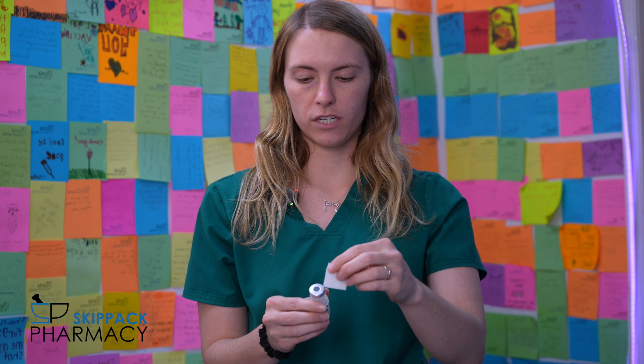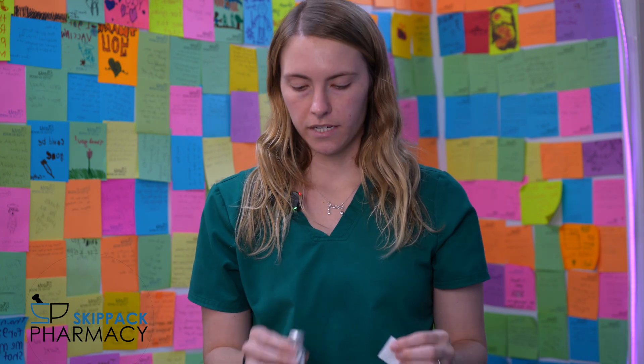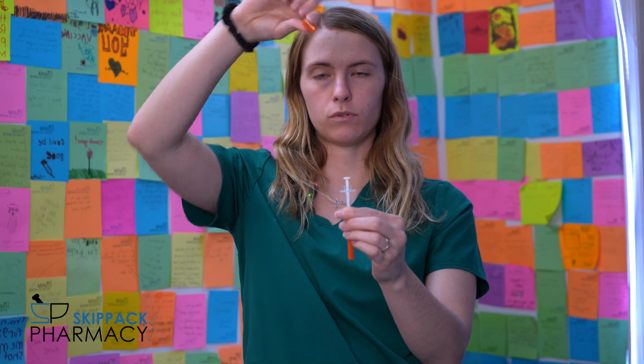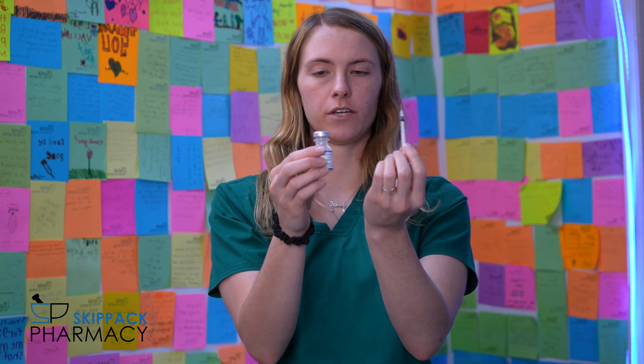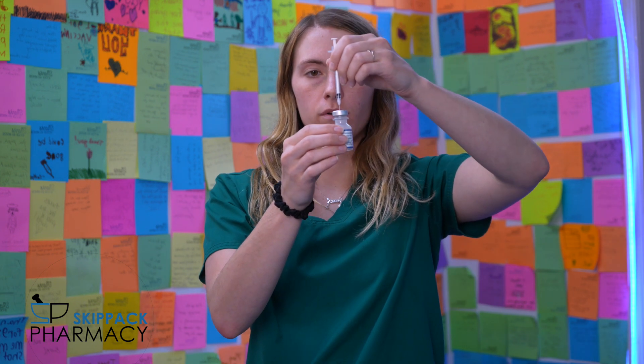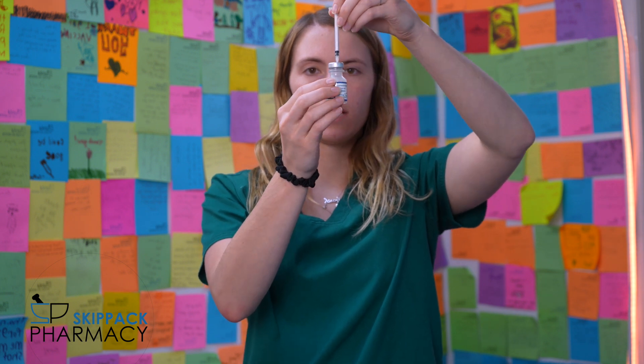Before you put your needle in, you want to make sure you rub the rubber top with the alcohol swab to make sure that it's clean. Next, take the cap off your needle — pull straight up, that'll pull it off the plunger — and the same for the needle cap. Once your needle is exposed, be sure not to touch it because you don't want to poke yourself. Then grab your vial and take your needle and put it at a 90-degree angle straight into the rubber portion of the vial.